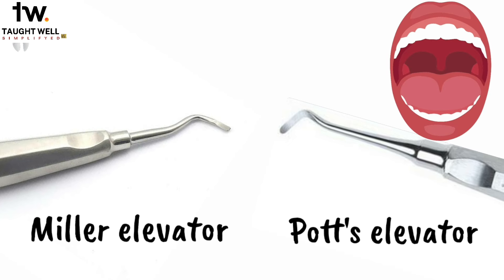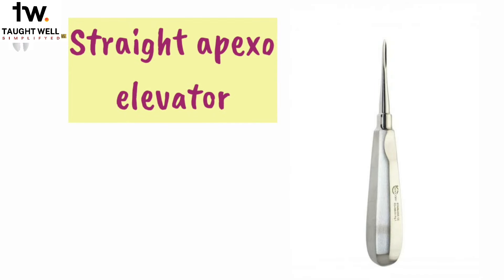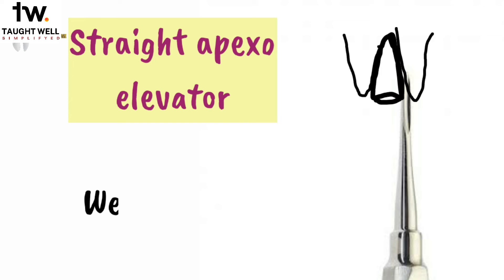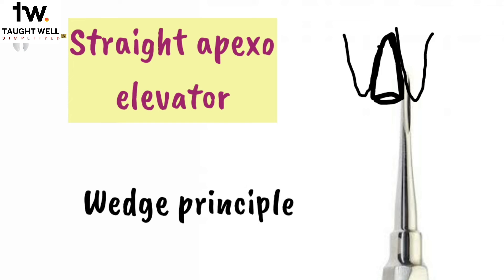The Apexo elevator is also available as a straight Apexo elevator. This one is used for luxation and elevation of fractured roots of maxillary anterior teeth. You can see the working tip is sharp and straight — it gets wedged between the root and the bone, so this works on the wedge principle. We will talk about the principle in more detail later on.